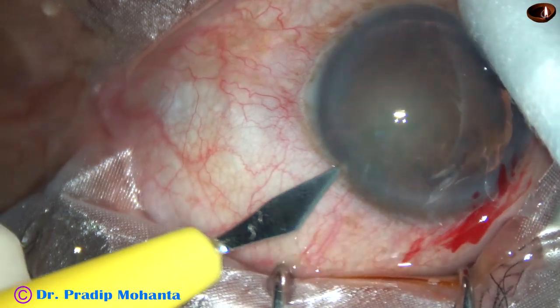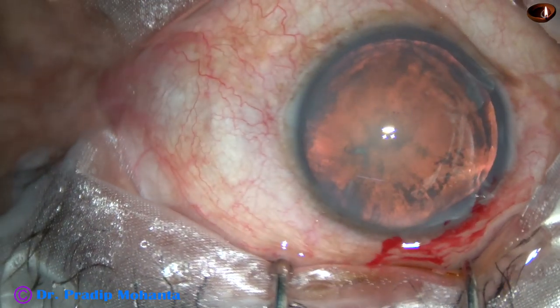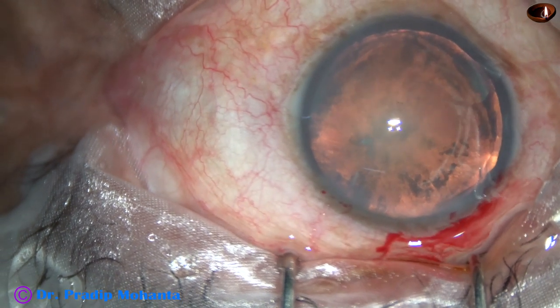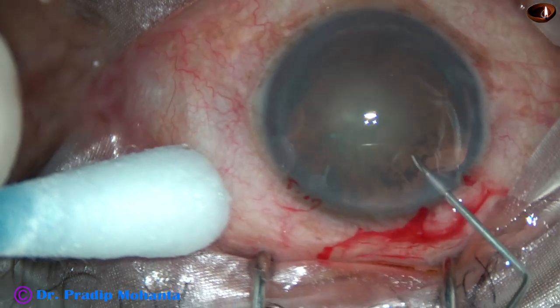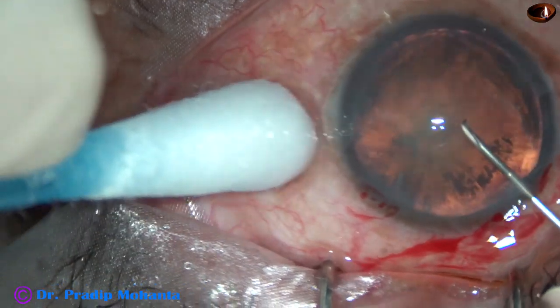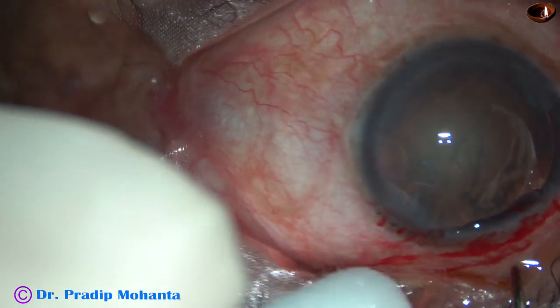In this case, I have done only one side port. The main incision is at around 10:30 o'clock. The side port is at around 1:30 o'clock. The anterior capsule is incised with a 26-gauge band needle.